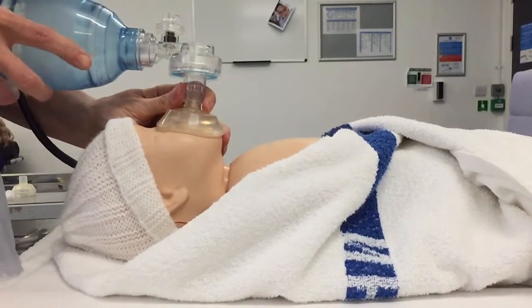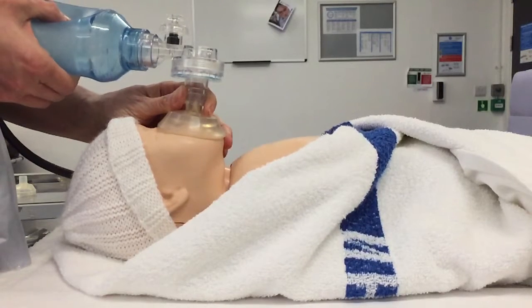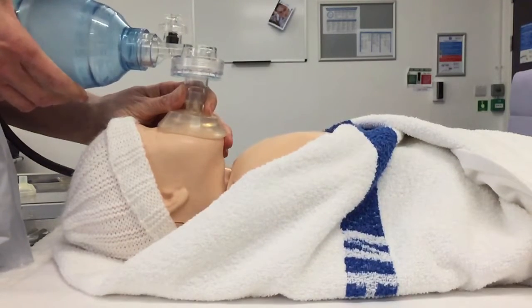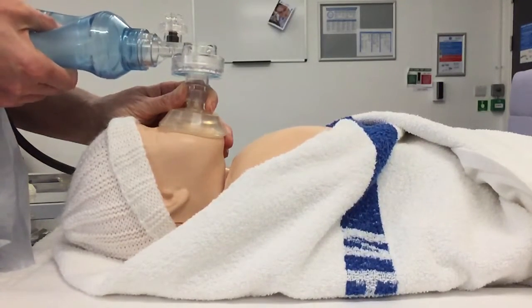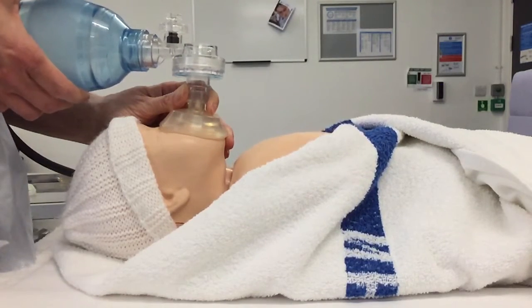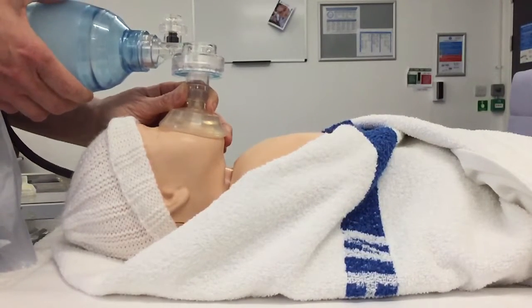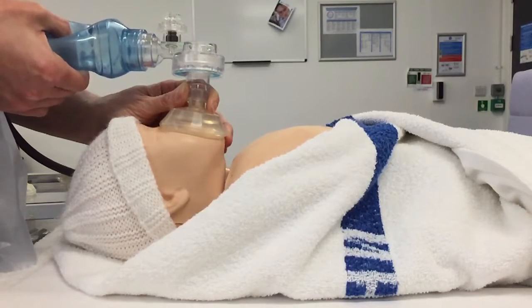There's a mask with a C and E grip supporting the baby's jaw. I'm going to give five slow sustained inflation breaths. One inflation breath, release. Two inflation breaths, release. Three inflation breaths, release. Four inflation breaths, release. Five inflation breaths, release.